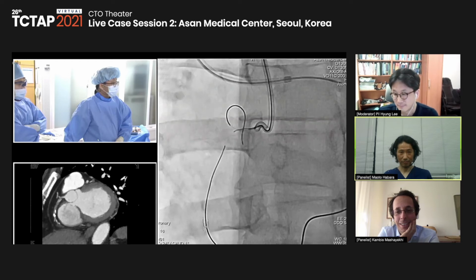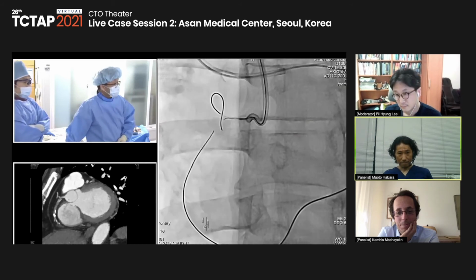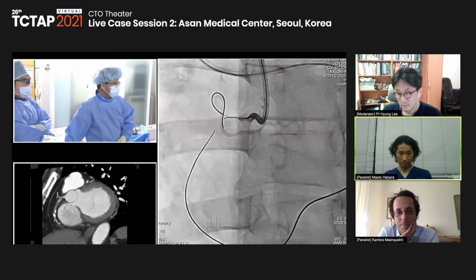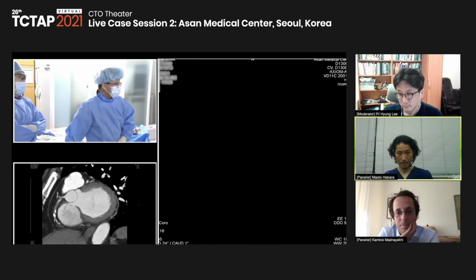I again used the Sasuke microcatheter and Conquest Pro 12, and then tried to advance the wire where I wanted it to go in.